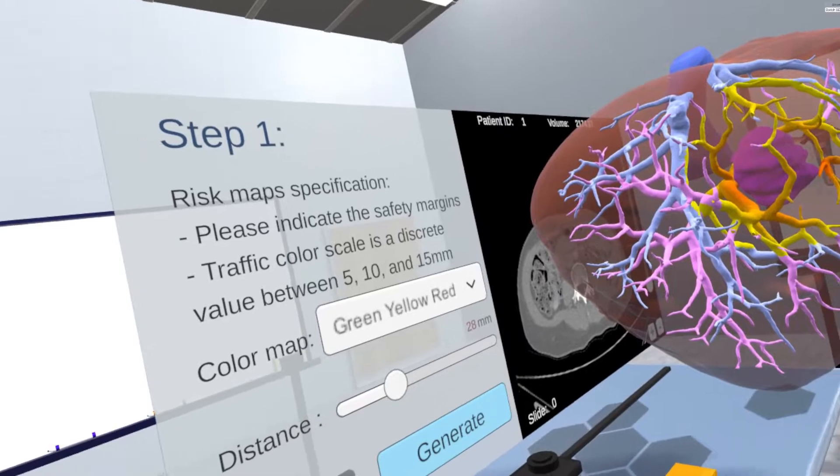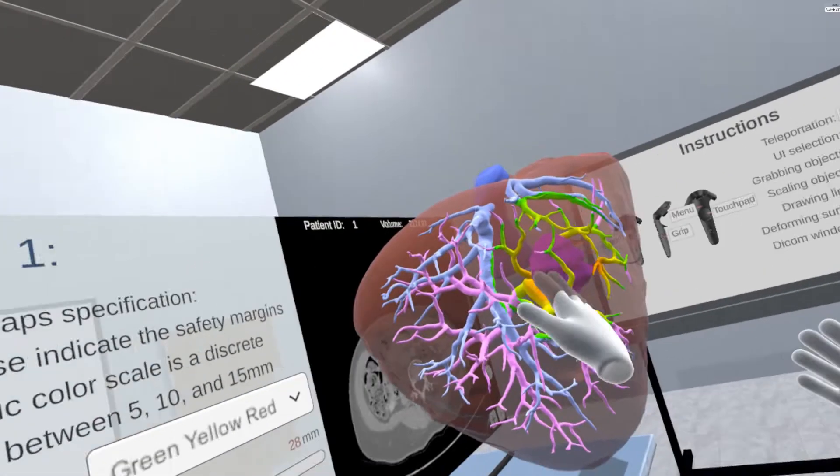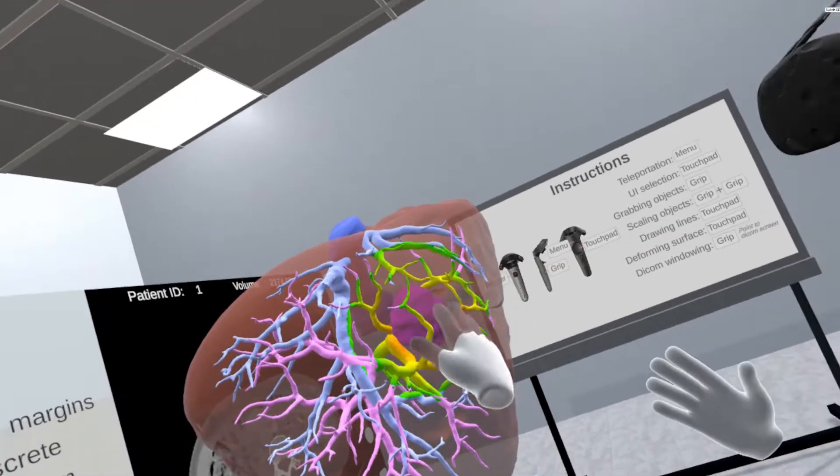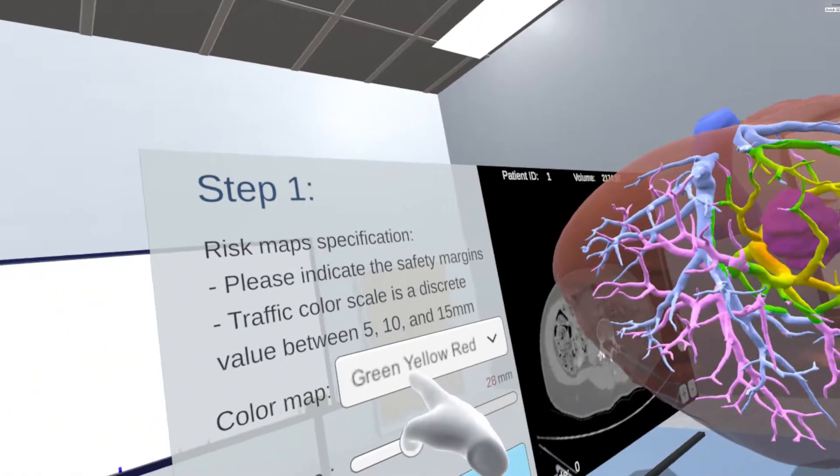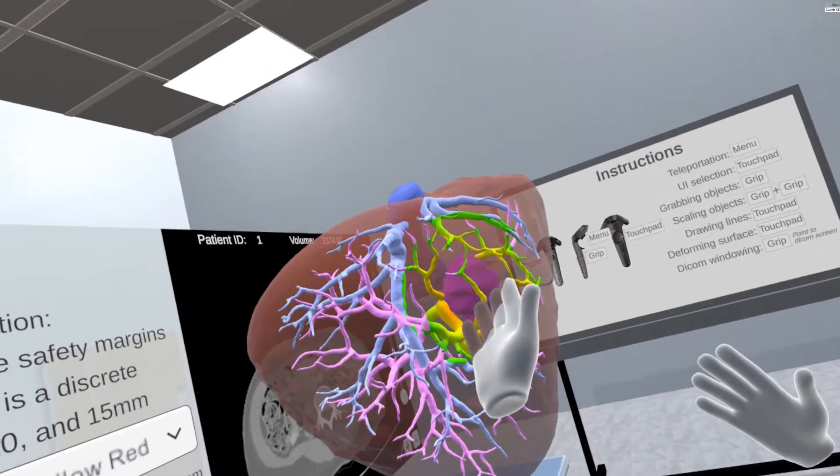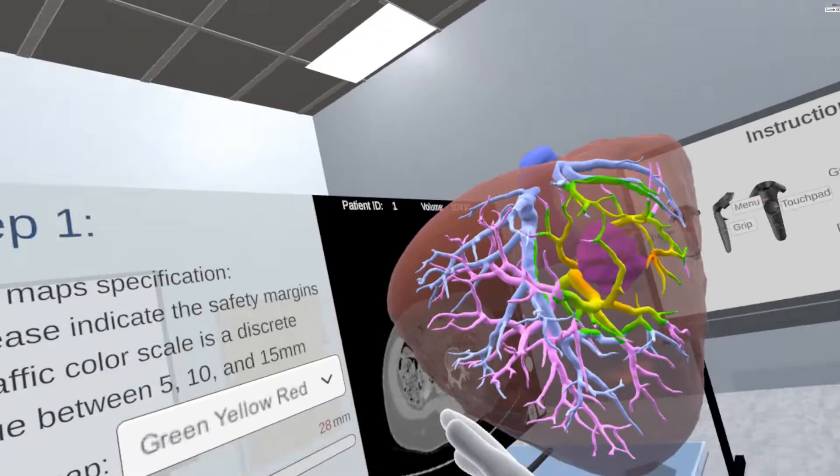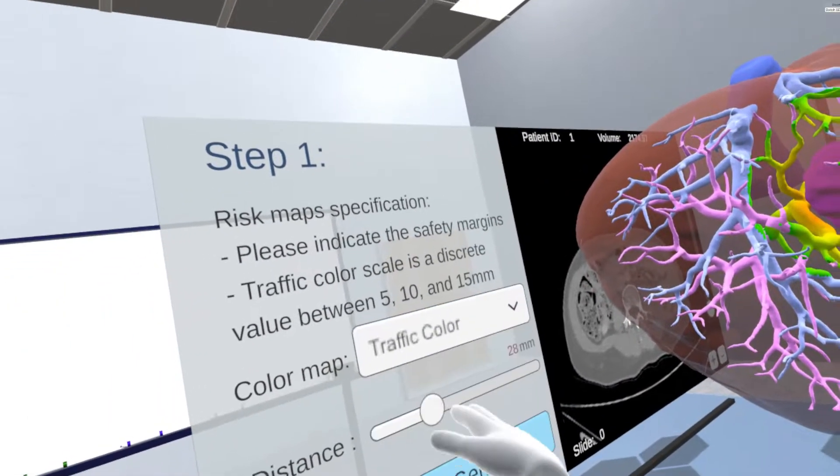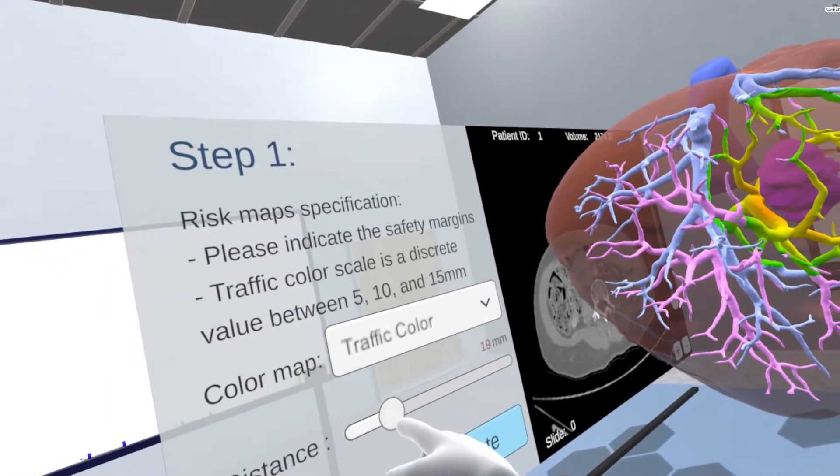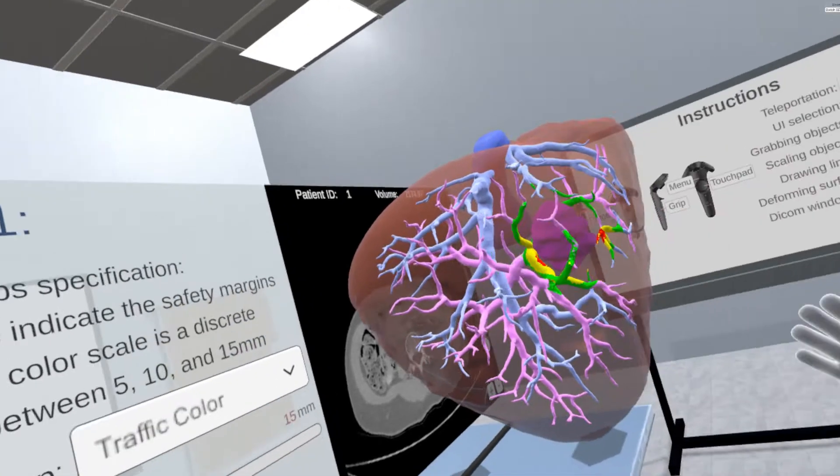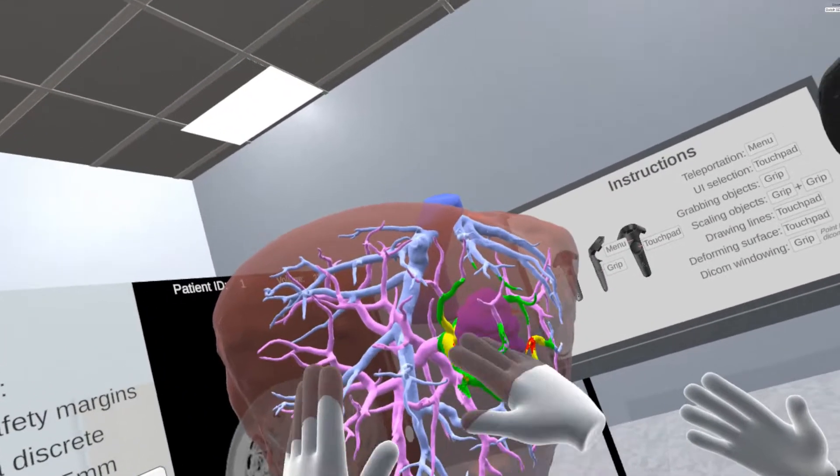Below 5 mm margins are indicated with red color which means it must be resected. The margin between 5 to 10 mm is visualized with yellow color, and between 10 to 15 mm is indicated with green color. The safety margins of more than 10 mm only add little value to the outcome, however, it is reasonable to consider them.